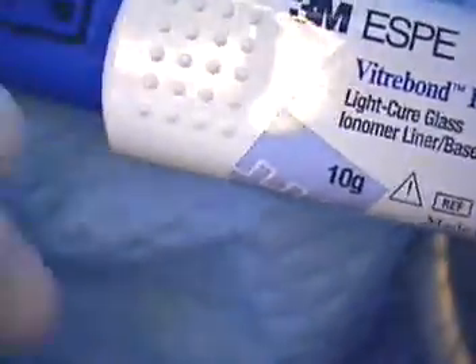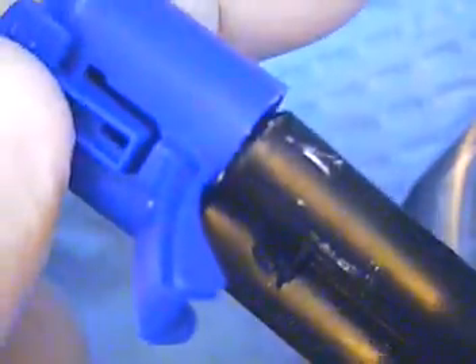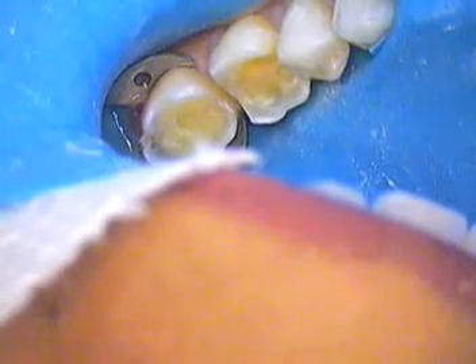Terrific stuff to use. You just undo this clip right here — you've got two barrels, you squeeze that out, and then you mix it by hand, and off you're running. So base and catalyst — simple. The old method, you had to take out a powder and mix it by hand. I didn't like that.